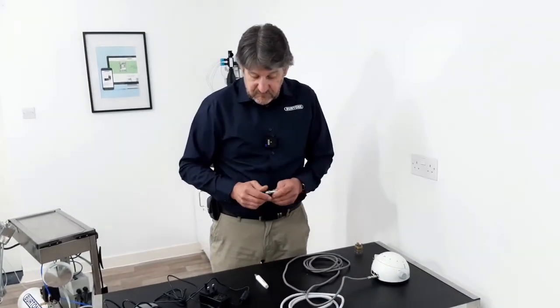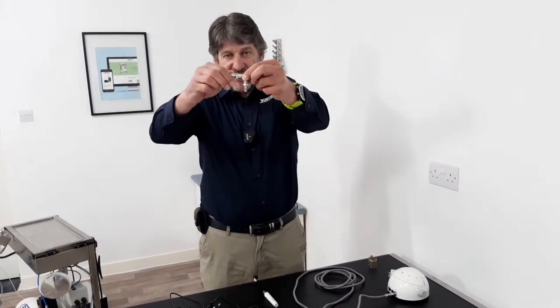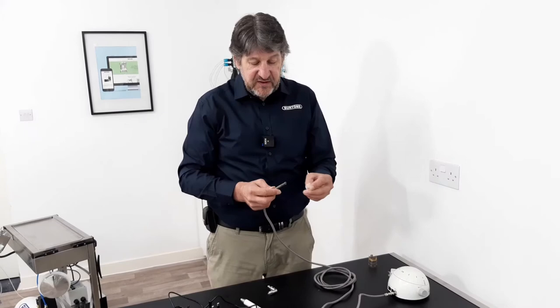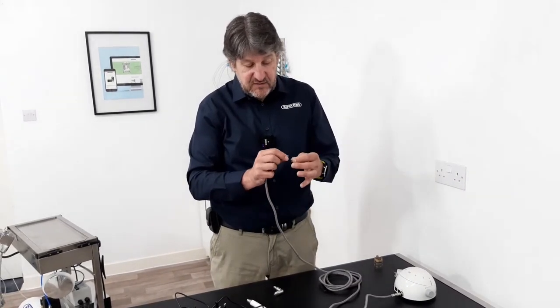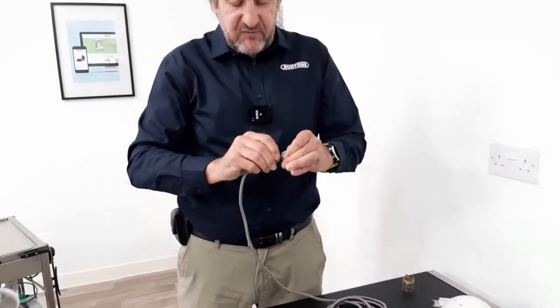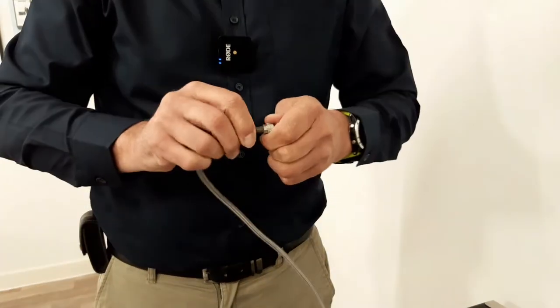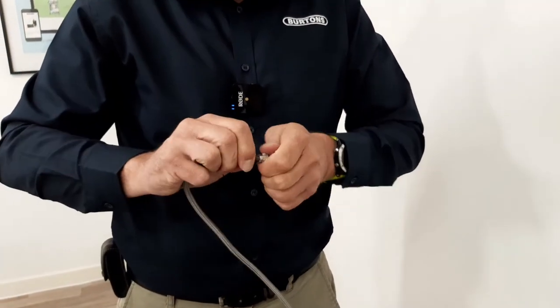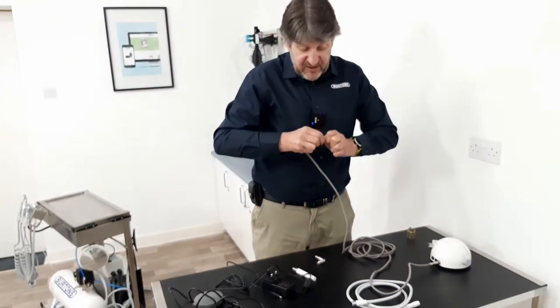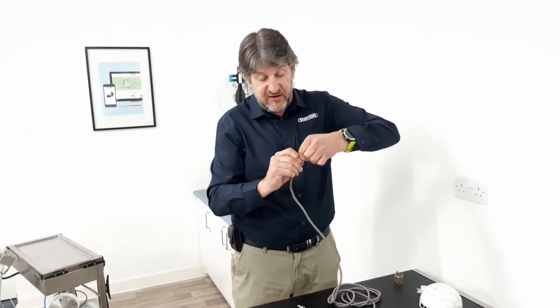Supplied with the Vetter Classic is this L bracket, and this L bracket has a lock ring. The lock ring needs to be placed first onto the hose, and you may need to rotate until the lock ring can slide down. It has to be a tight fit to avoid any leaks, so just keep pressing and rotating until it can slide.